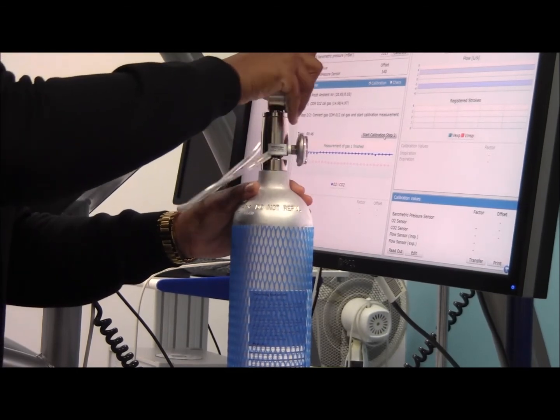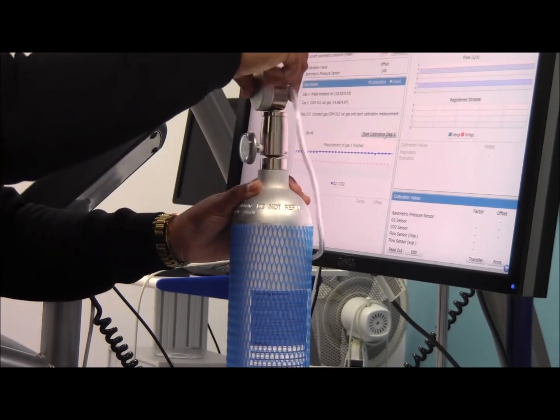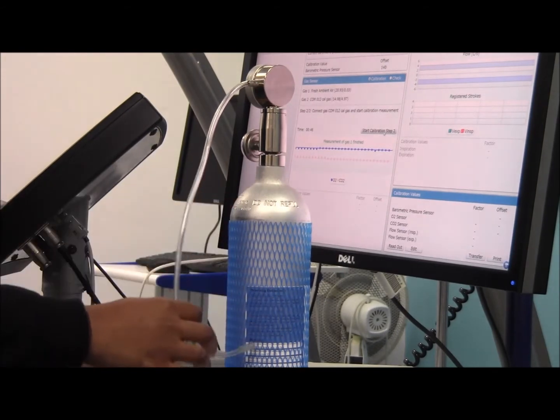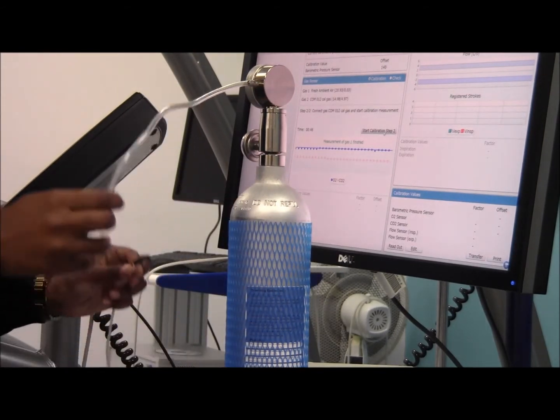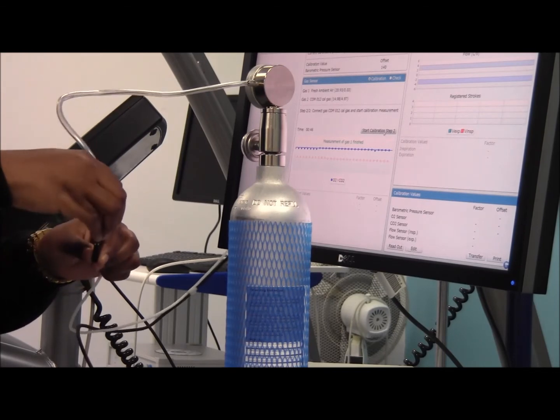Once this is done, connect the pressure gauge to the certified calibration reference gas. Once screwed in, double check the pressure is not low, and then connect the sample line to the end tube of the gauge. Then click start calibration part 2.